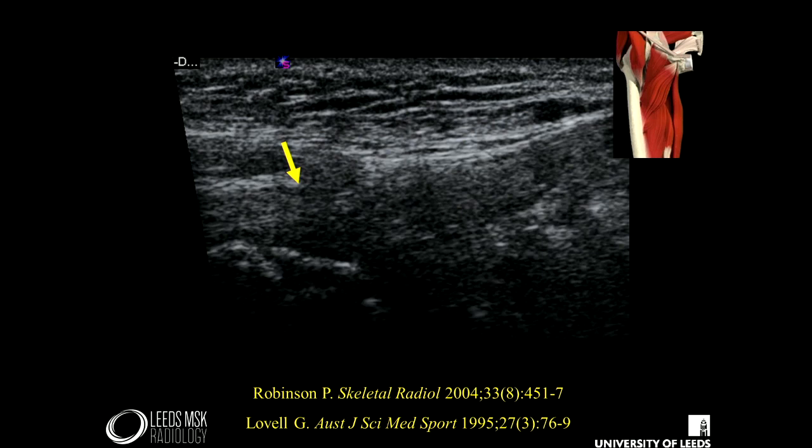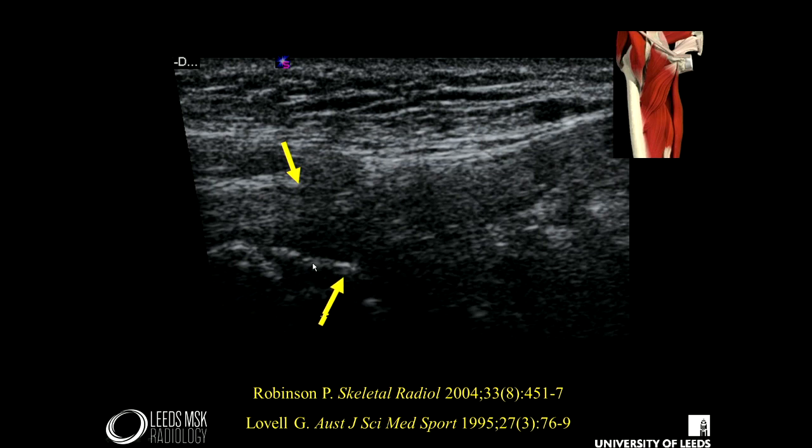You can see this on ultrasound — there's the adductor longus blending with the tissues anteriorly, and more inferiorly we have the cortex of the pubis. But you don't get the good separation and definition of tissues as you do on MRI. So MRI really remains the imaging modality of choice for assessing this area.